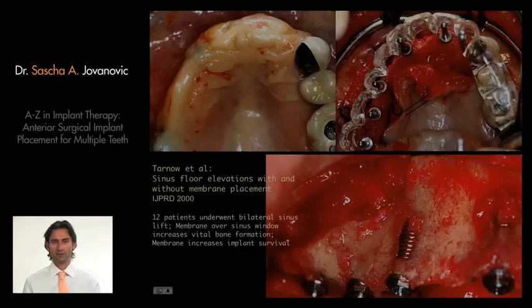Well, multiple teeth are missing, as you can see. It's 2 molars, premolars, and the whole anterior ridge. So we're going to treatment plan her now for multiple implants. But interestingly enough, first of all, we're going to do a staggered approach. The staggered approach means that in the anterior, we're building in pontics for aesthetic reasons, and in the posterior, from distal of the canine, we're going to place implants for teeth so we have more stable function. So this particular patient will be a combination of anterior and posterior treatment.